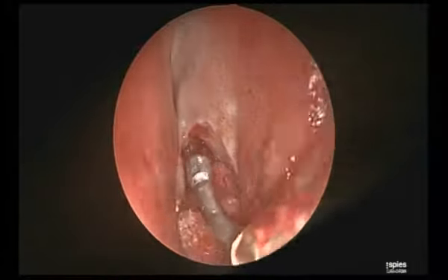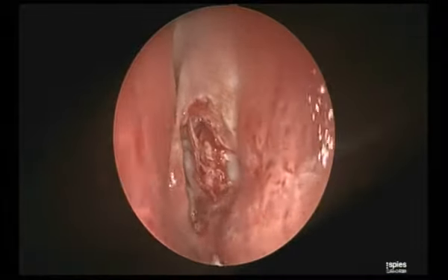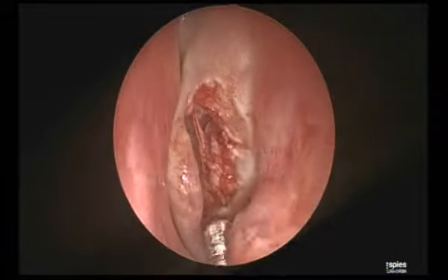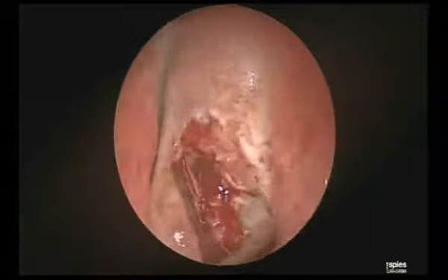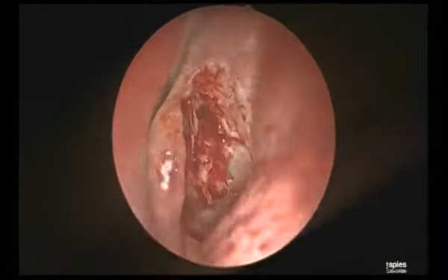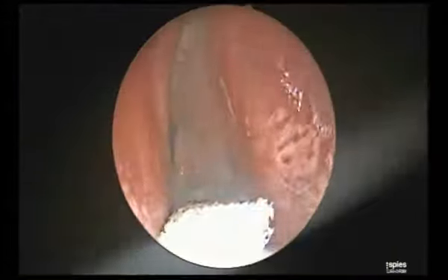Now, what I'm trying to show, now I've changed to a 70-degree telescope. We are seeing the lateral limit, we are seeing the lamina. This is the telescope of my choice for sinus surgery. For any sinus surgery, if I am given a single telescope, I'll opt for 70, not for 0. This is the most versatile scope.